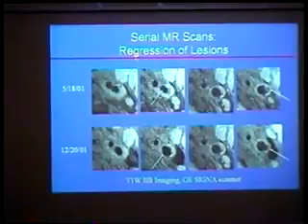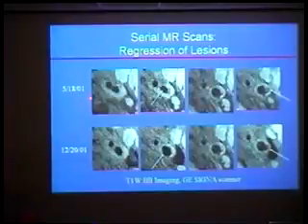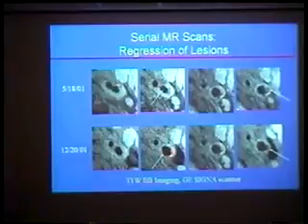The second one is a regression study. Again, this is a patient taking statins, a cholesterol lowering treatment. This is what you see at time 1, and this is what you see at time 2. In between is only about half a year. You see that a pretty significant change has already happened, especially at this location here. The lumen is widened. You almost feel like that part of the plaque has washed out, that it is depleted from the artery.